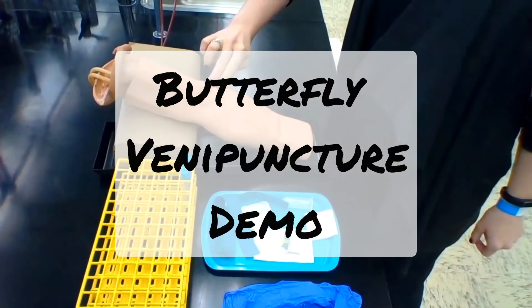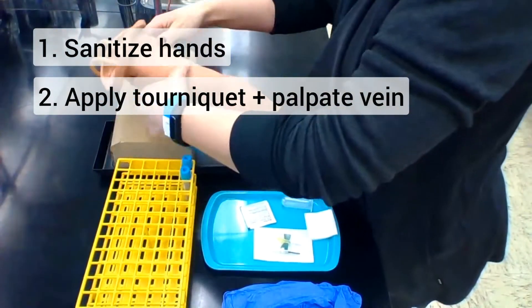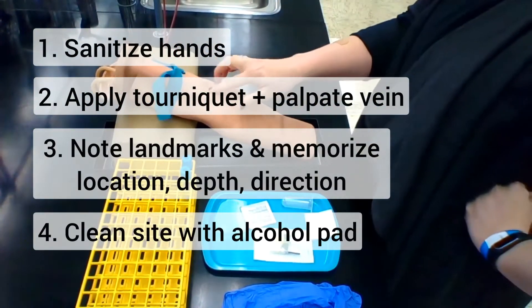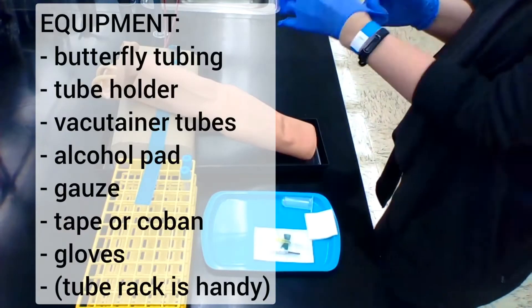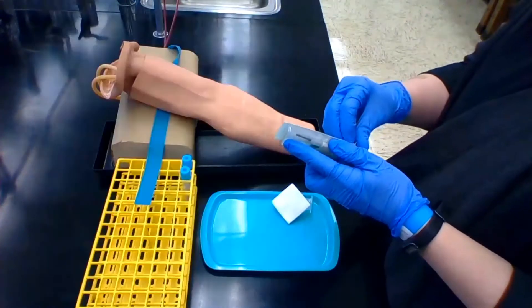Alright y'all, this is going to be a demo on how to do a butterfly venipuncture. If you need some notes on how to start a venipuncture procedure, you can watch my other video on this channel that will describe how to apply the tourniquet, how to palpate the vein, and all the steps that happen up until the needle goes into the arm.